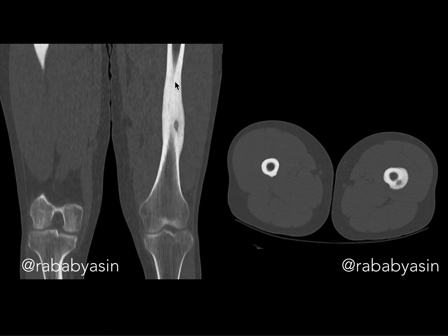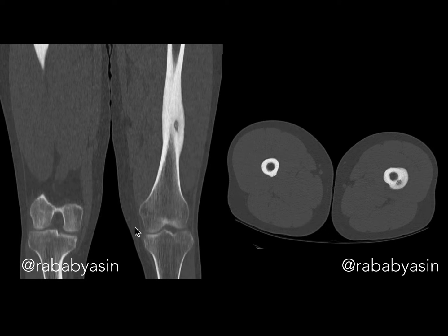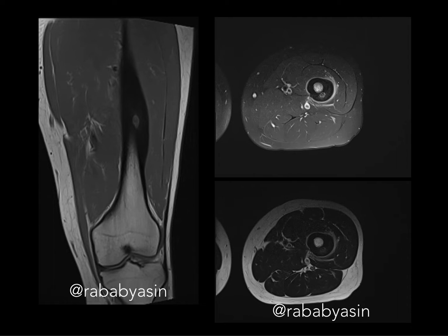Coming to CT, you can see the extensive solid periosteal and reactive bone thickening along the lateral aspect of the mid shaft of the femur. On the axial sections, you can see the left femur with extensive thickening and a central lytic nidus, with some amount of mineralized cortex within the nidus. This is a very classic and typical appearance of osteoid osteoma, with no other lesions in the same long bone.